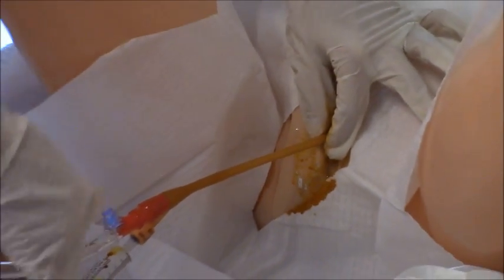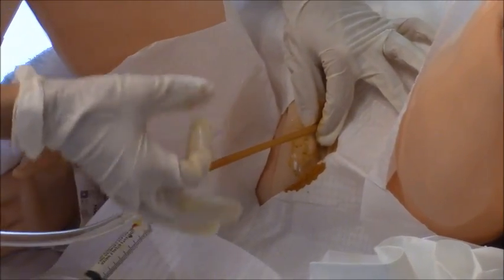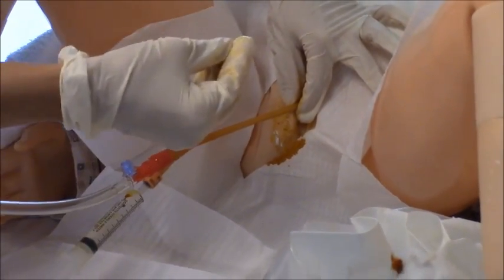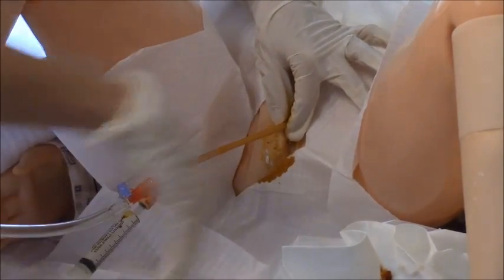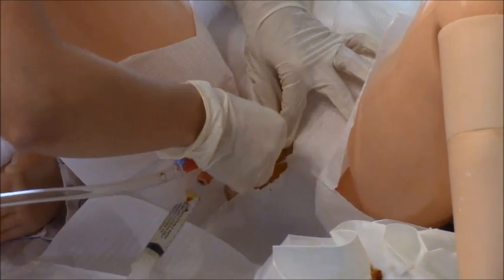On the mannequin it's easy to see the opening. Insert the catheter into the urethra and keep advancing. While inserting, watch the tube — once you hit the bladder you'll see yellow urine filling the chamber. When you see urine, advance a couple more inches to make sure the catheter is fully inside the bladder before inflating the bulb. You do not want the bulb to inflate between the bladder and the urethra, as that would cause the patient significant pain.